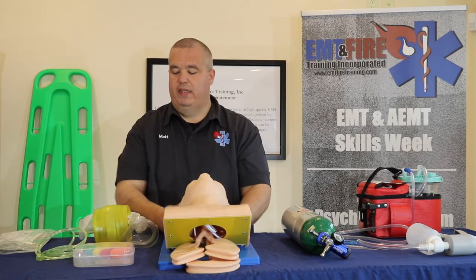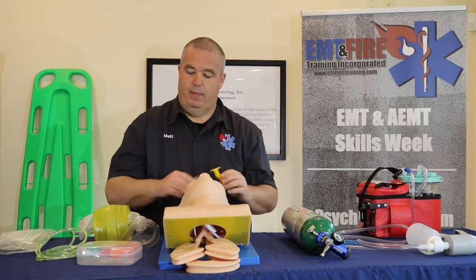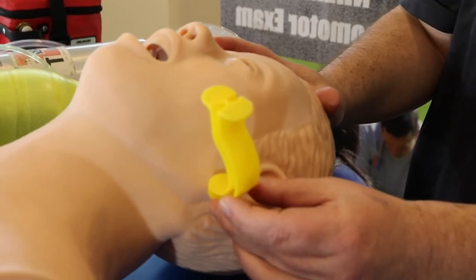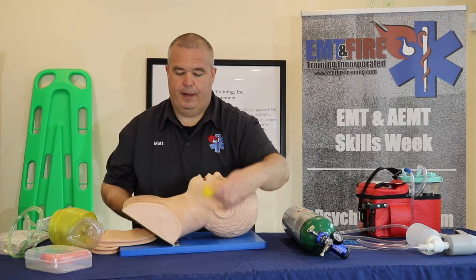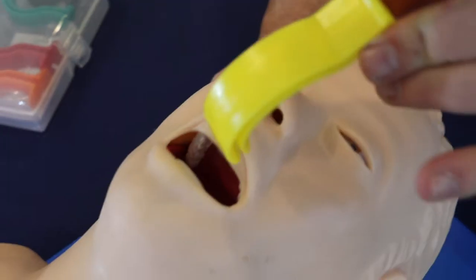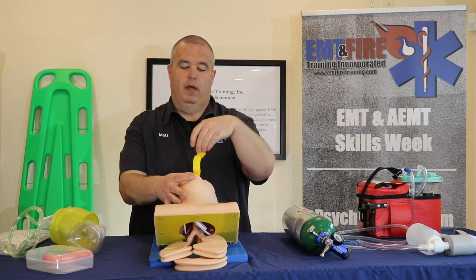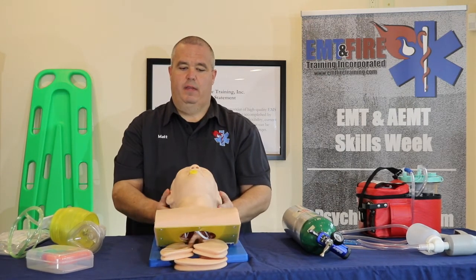Once his mouth is clear, we need to put in an oral adjunct — this is called an OPA, or oropharyngeal airway. We need to measure it from the earlobe to the corner of the mouth. For this specific patient, the yellow OPA is what we'll use. To insert it, you can insert it upside down until you feel resistance and then twist so it sits down on top of his teeth, or you can come in at a 90-degree angle until you feel resistance and twist down.